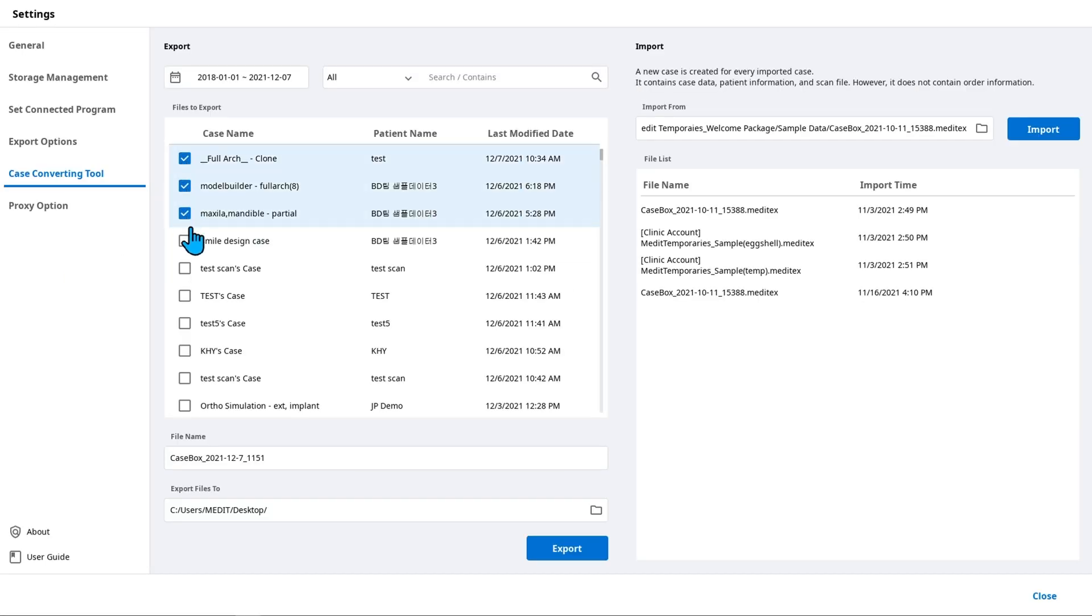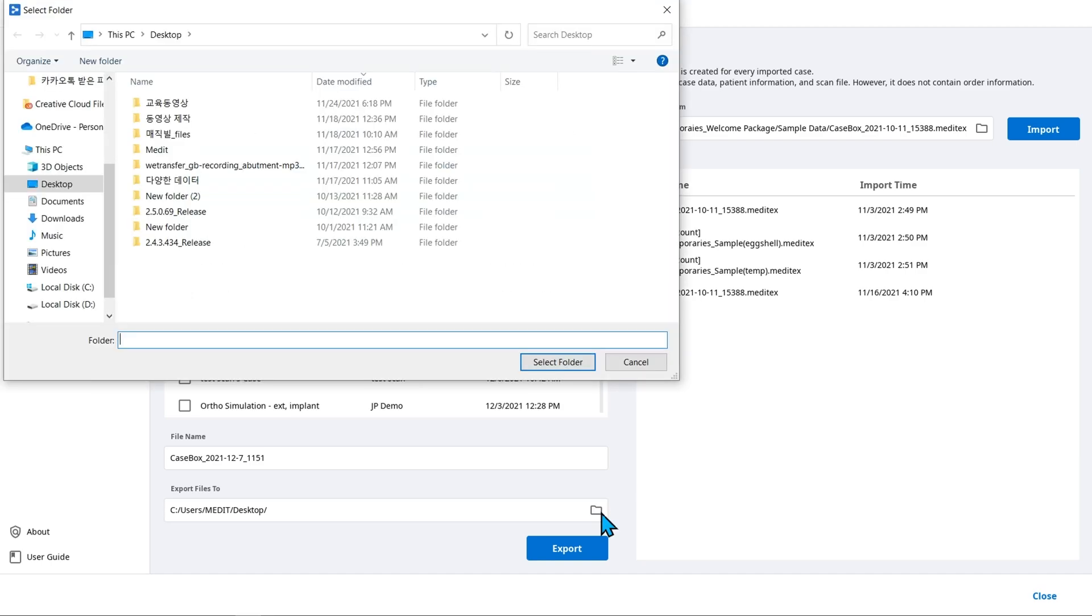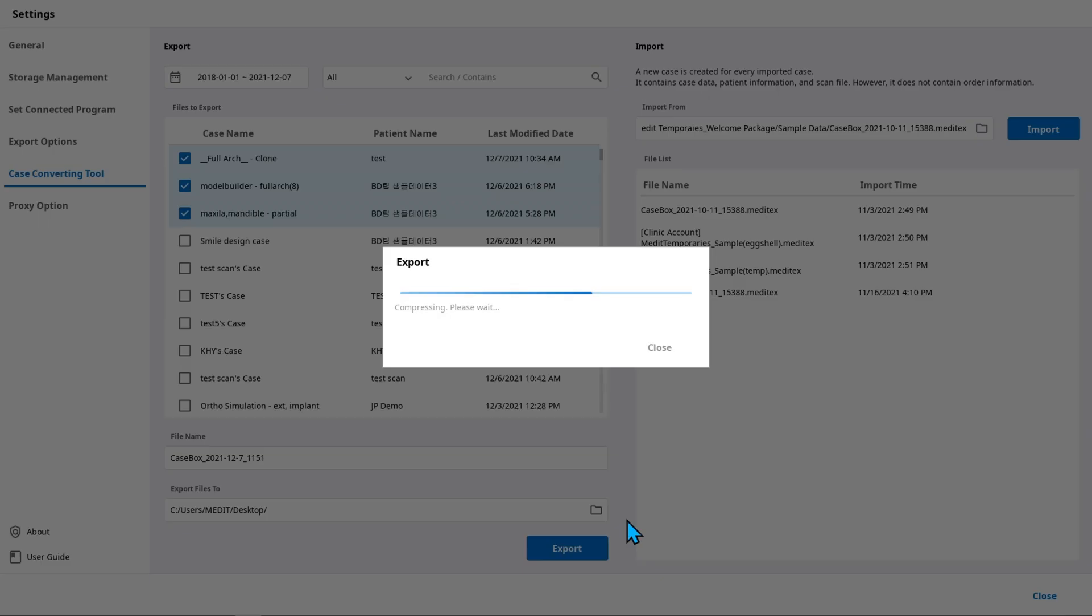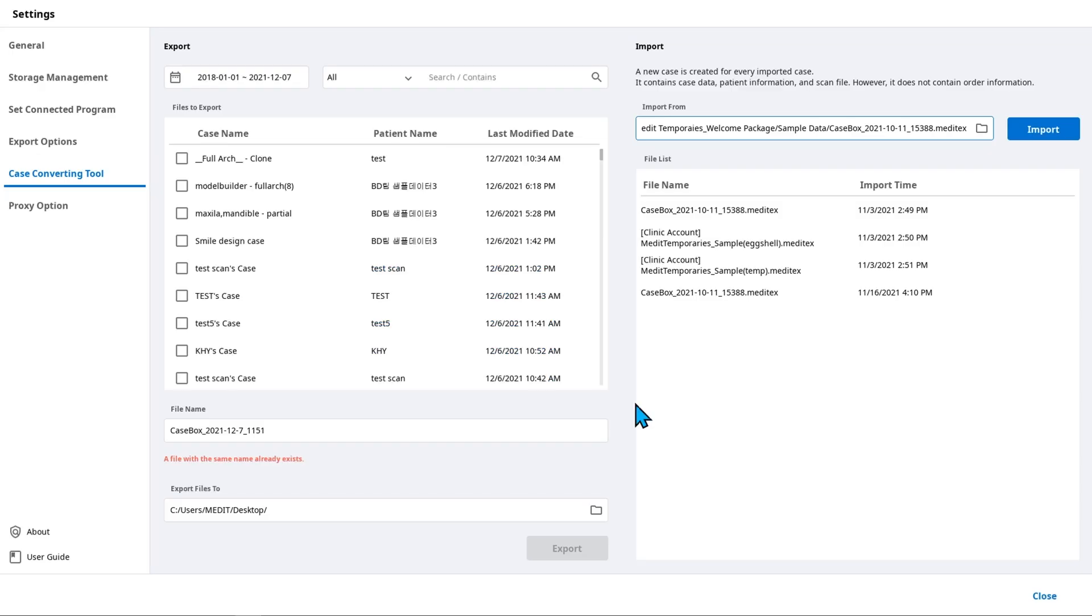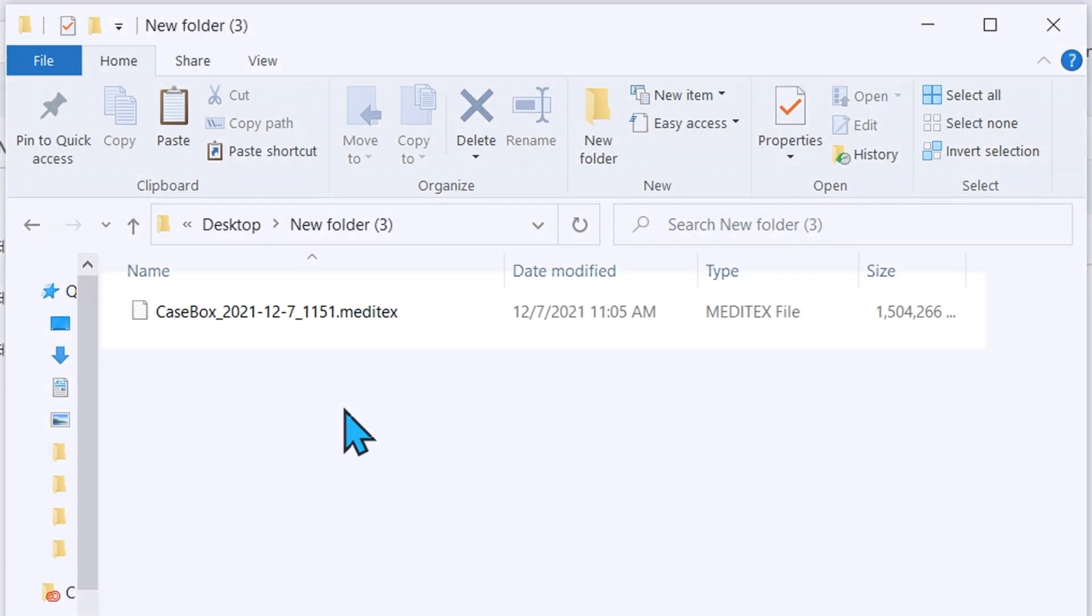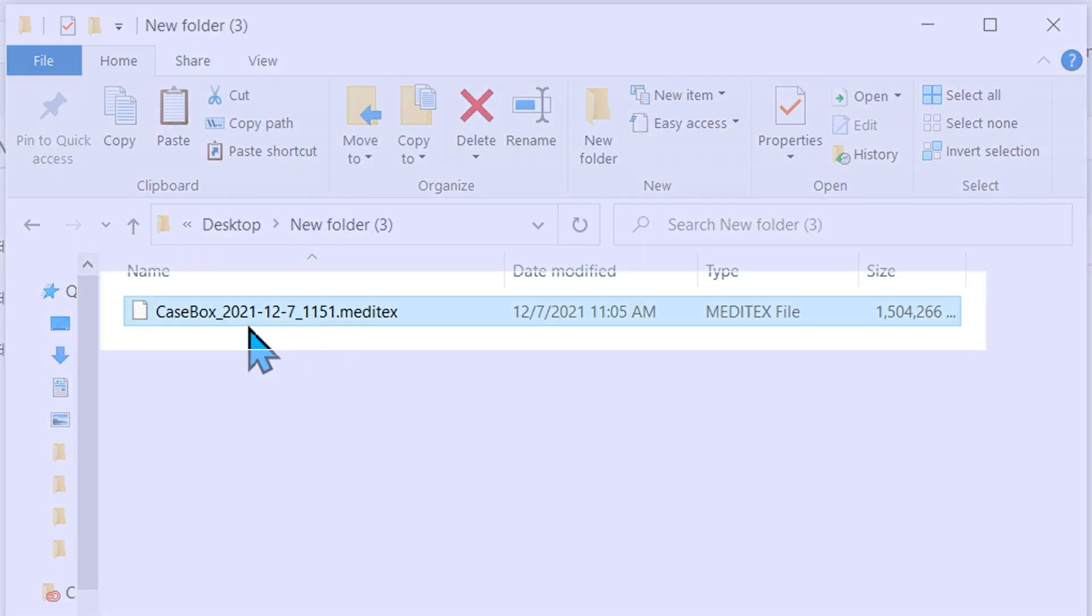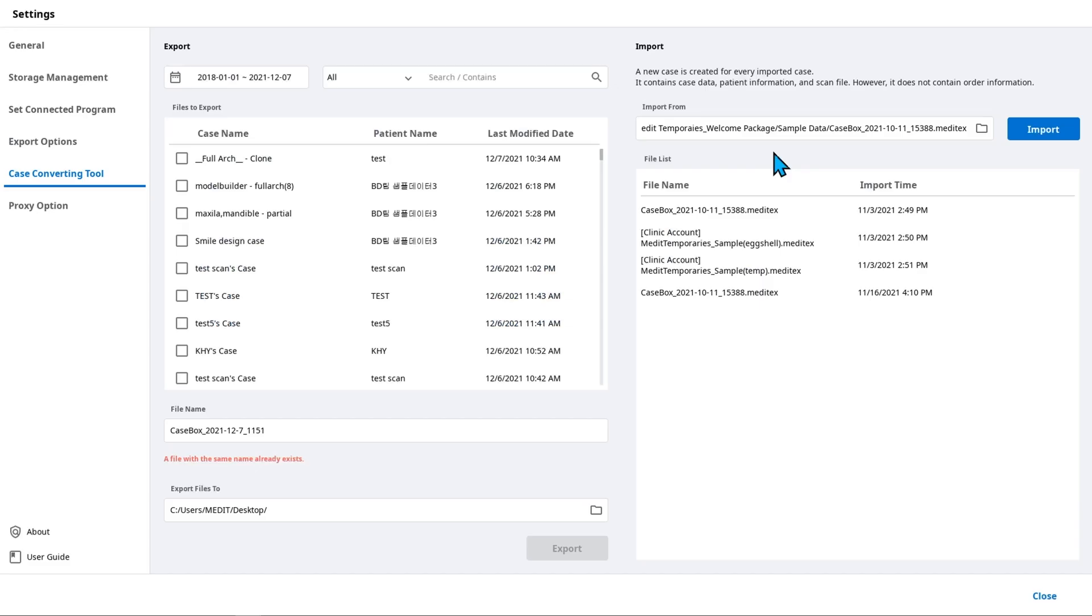In the export section, select cases to be compressed and choose the export location. Even if you select to compress multiple cases, the backup file format will be Meditex.